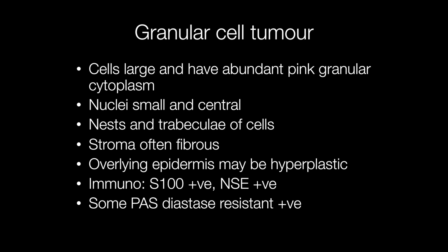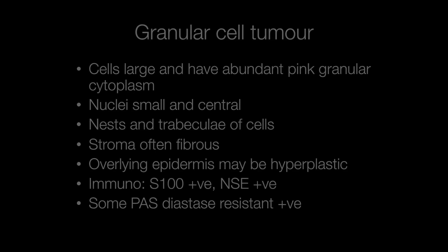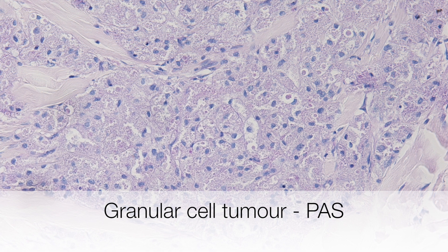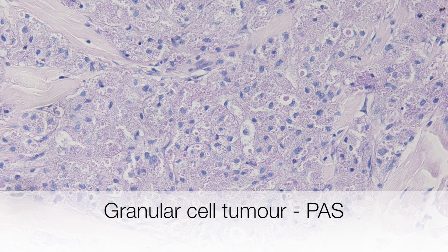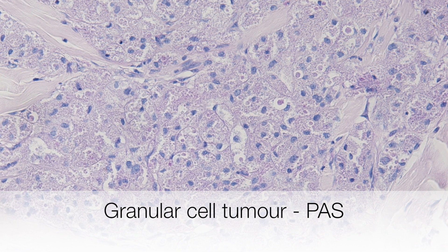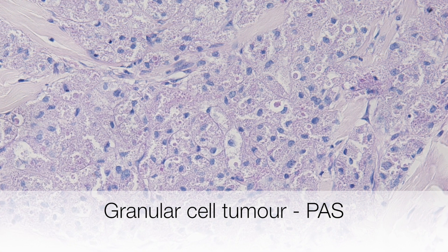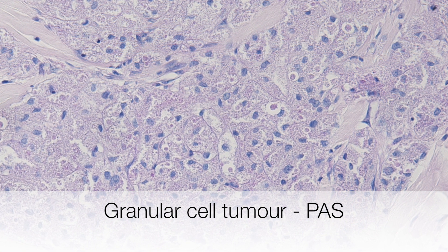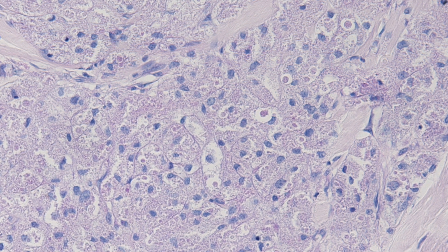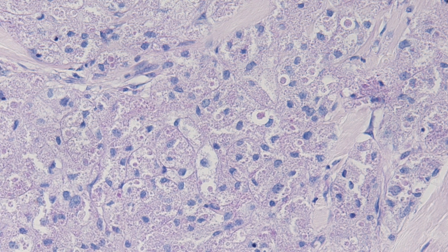Useful immunostains for granular cell tumours include S100 and NSE, both of which are positive, and a proportion of granular cell tumours show PAS diastase-resistant staining. This granular cell tumour has been stained for PAS and there is no magenta staining, so the PAS stain is negative. This is not surprising as only approximately 30% of granular cell tumours show positive PAS staining, illustrating that PAS is not a particularly useful stain given that the majority fail to stain for it.